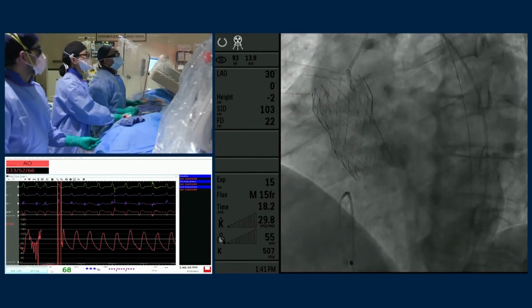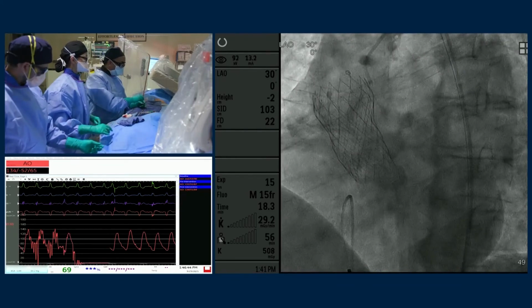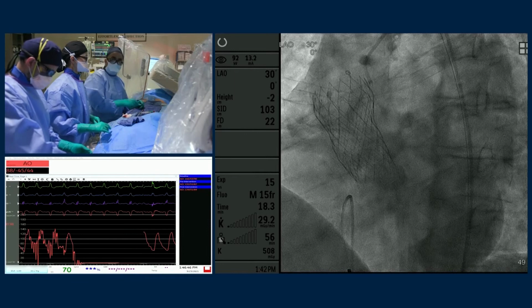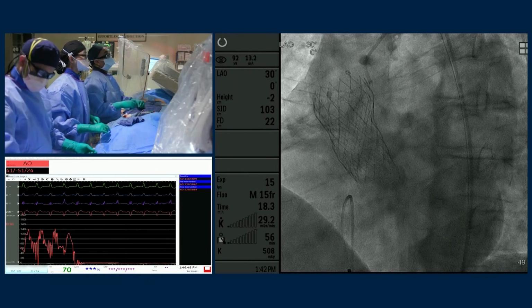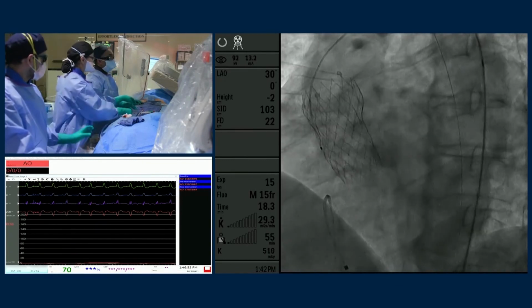And I think, as I recall, you said the other reason you need the echo, of course, is if anything happens, if we get sudden hypotension, you can pretty quickly demonstrate what's going on and whether there's any concerning complication that needs addressing immediately.